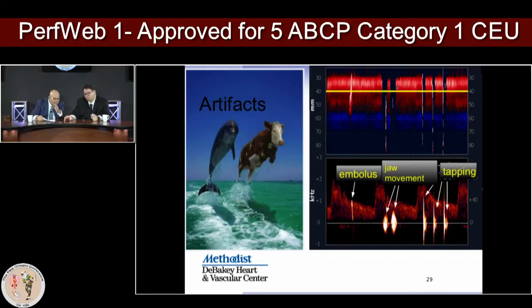And is there an angular component to it as well? So the angulation is probably, you can see it on the embolus if you see that the proximal MCA, while it's traveling to distal, it takes time. So this is the distance from 60 millimeters to 30 millimeters. So that's only a 3 centimeter trip. So this is not a trip to the moon, but it's just a trip to your cortex.